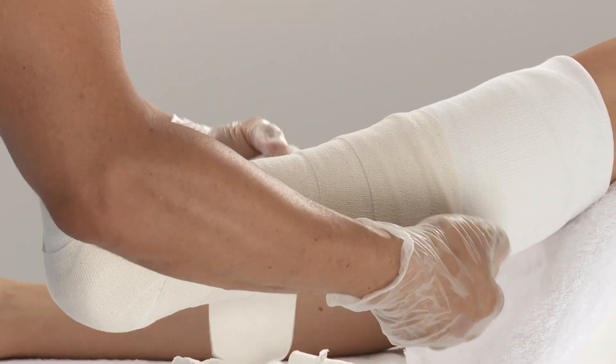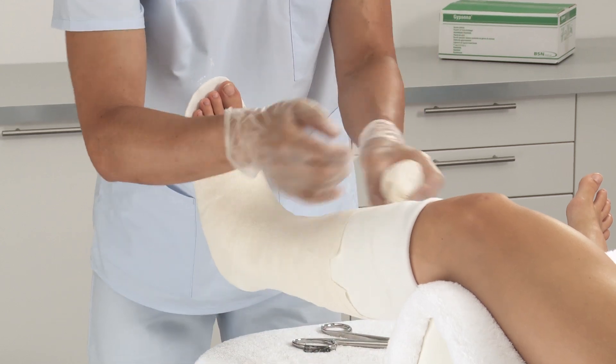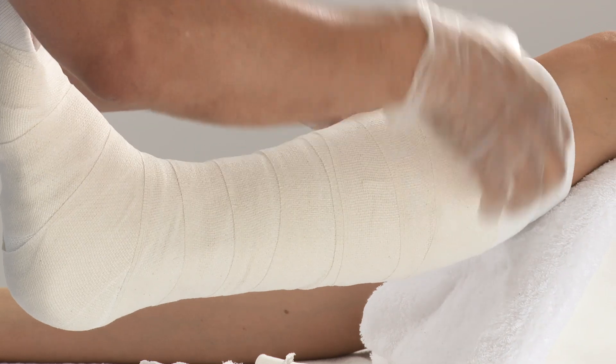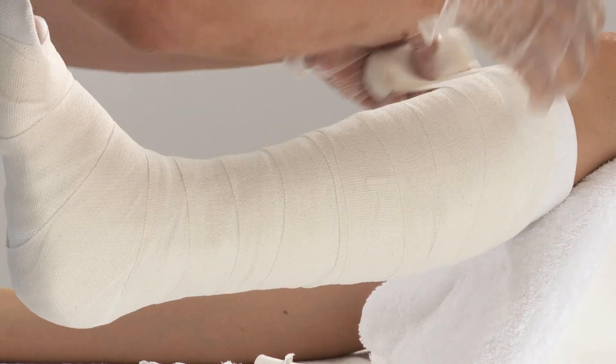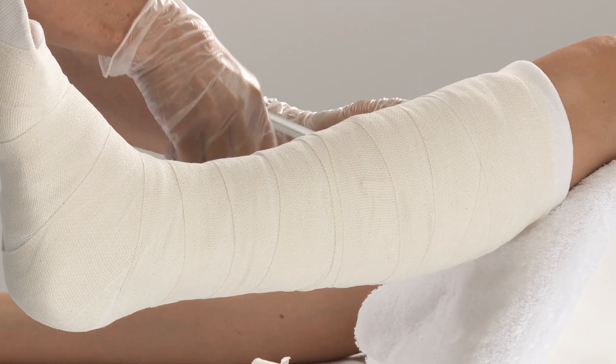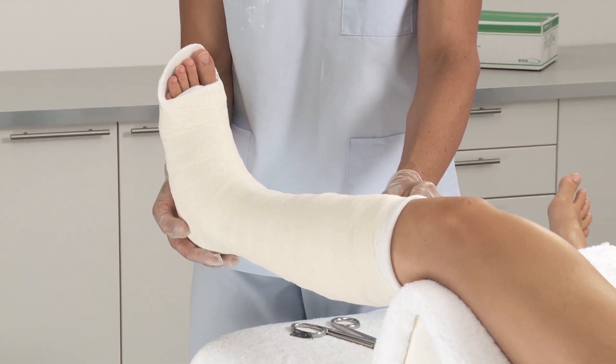Use a second bandage if needed. Check for desired range of motion and any points that may cause irritation or pressure. After approximately 3–5 minutes, the splint is set and the patient can be released. After 24 hours, the splint is fully set.